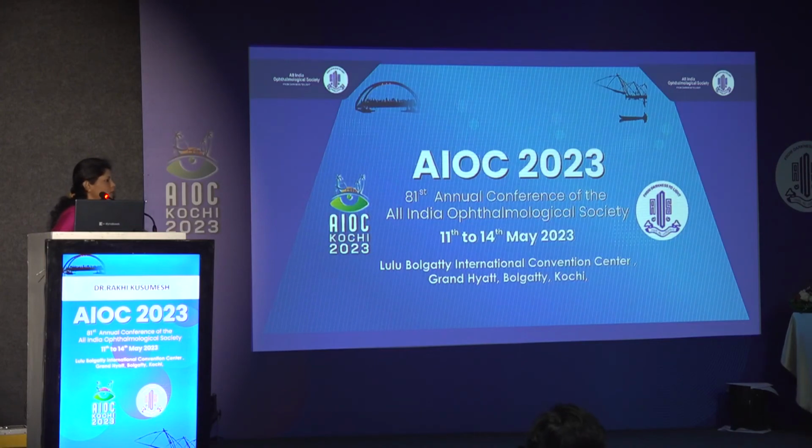It is not mandatory to do specular microscopy in all the cases, but to learn better things or to anticipate some problems, you can advise it in particular cases where you are thinking that the case may need some additional procedure, like in cases of pseudoexfoliation or chronic glaucoma, or if there is any history of viral keratitis, then in these cases this test is mandatory. Otherwise, just for your satisfaction or depending on the type of procedure you are planning, you can do this test. There is no harm in doing a specular microscope in all the cases.